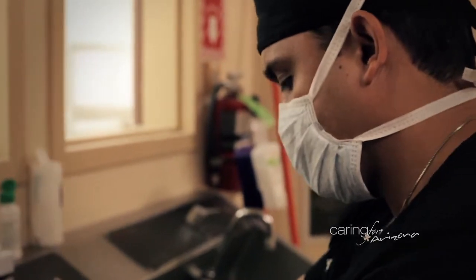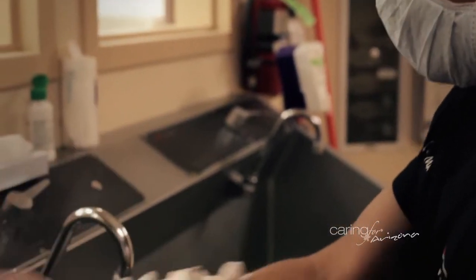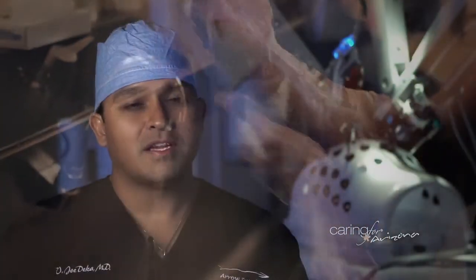Laparoscopic surgery is a minimally invasive way to enter the body to do general surgery cases, whether it be on different solid organs like the gallbladder, liver, or the colon, or the stomach. Operations that typically would take a large incision in the front of somebody's abdomen, we can do with smaller incisions and less pain afterwards. The benefits of laparoscopic surgery are much smaller incisions, cosmetic appearance, and the ability to recover from a surgery that might take 4 or 5 days, you might recover in 2 or 3 days. It's a little easier on the patient.